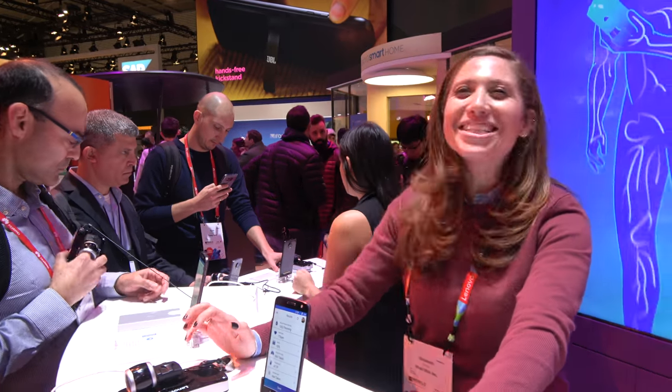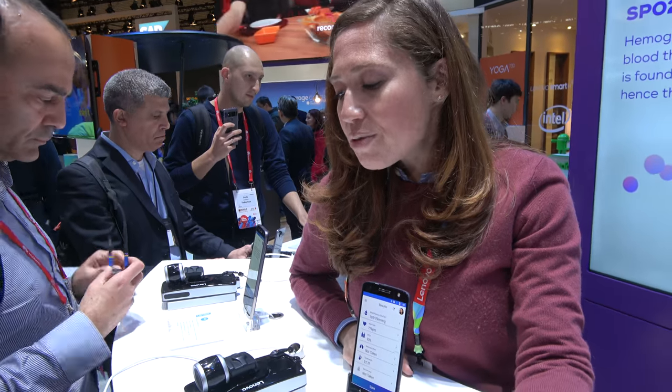It's a great solution for clinics as well. If a group of friends goes on a hike, one of them needs to have a phone with this mod and they can all get their measurements taken — check who's still doing okay, whose heart rate is better after the hike. We're seeing a trend towards people paying more attention to how their body reacts to different things, and this is a great tool to help educate our customers.